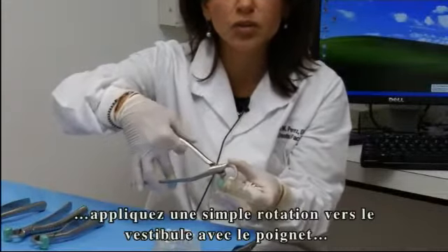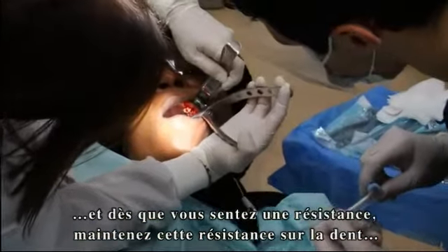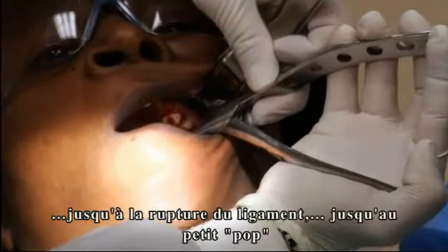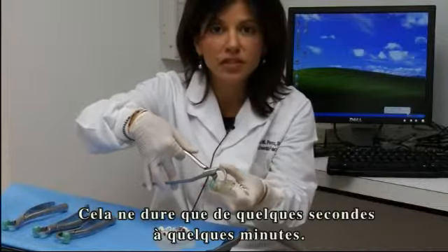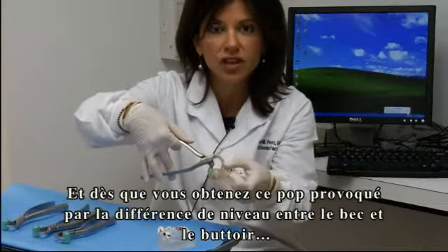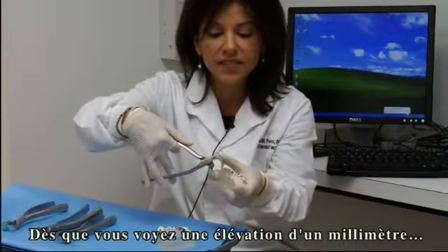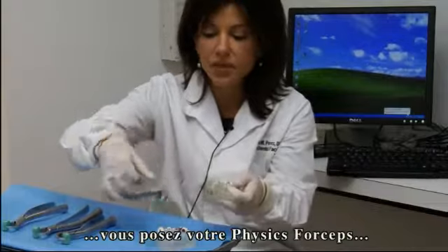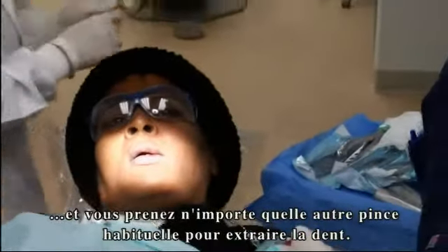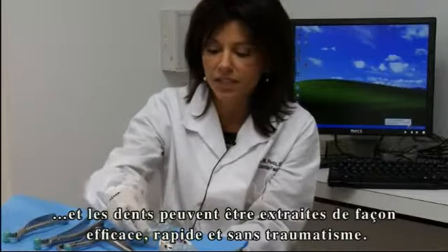Without squeezing the handles, a simple rotation towards the buccal is used with the wrist. As soon as you feel resistance, you hold that resistance on the tooth, allowing the periodontal ligament to break down and the bone to expand. You continue to hold it until you feel a little pop. Sometimes this can take anywhere from a few seconds to a couple of minutes. When you get that little pop, because of the placement of the beak and bumper at different levels, you get an arc of rotation and the tooth actually elevates slightly up out of the socket. Once you see or feel this little lift — about a millimeter or so — you stop with the physics forcep, put it down, and use any pincer device such as a rongeur or a universal forcep to remove the tooth occlusally. If done properly, it prevents any damage to the buccal plate, and the teeth can be removed quickly, efficiently, and atraumatically.